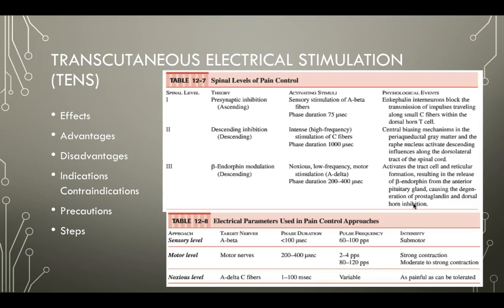Advantages, there's portability if you have the portable TENS units. It can be an alternative to cold for pain relief, especially during a technique that we call cryokinetics, which is the use of pain blocking to then be able to start exercise sooner. So again, we could potentially use TENS for that instead of the cold, and it's an alternative to medications for pain relief as well. Disadvantages, we're looking at the fact that this is all just pain modulation.